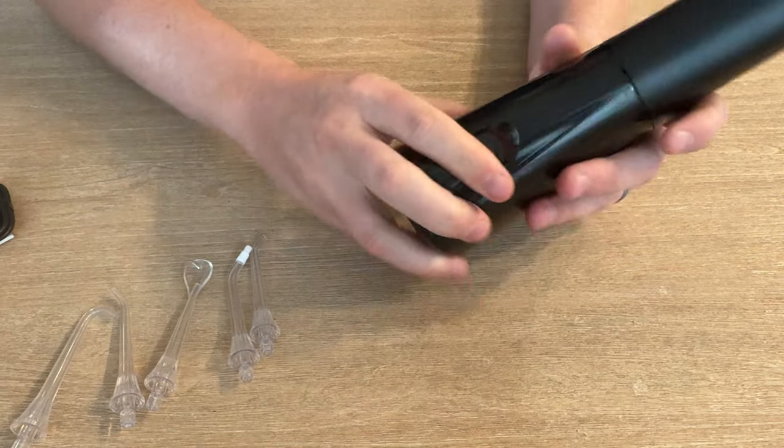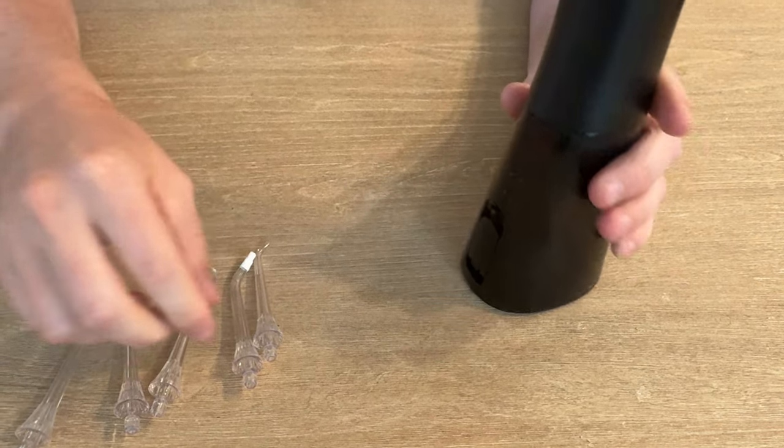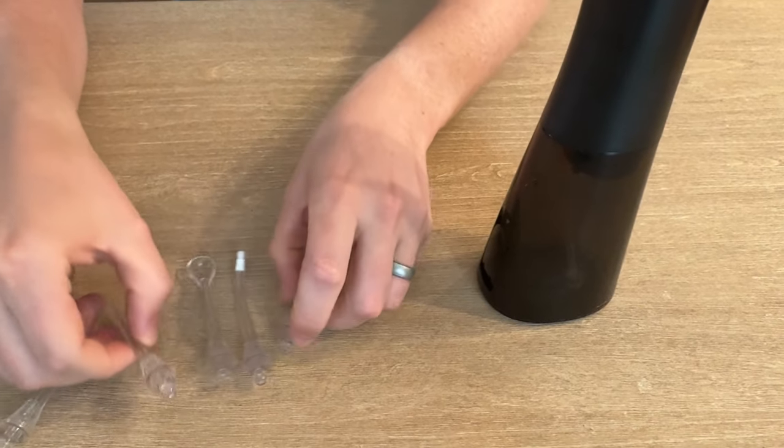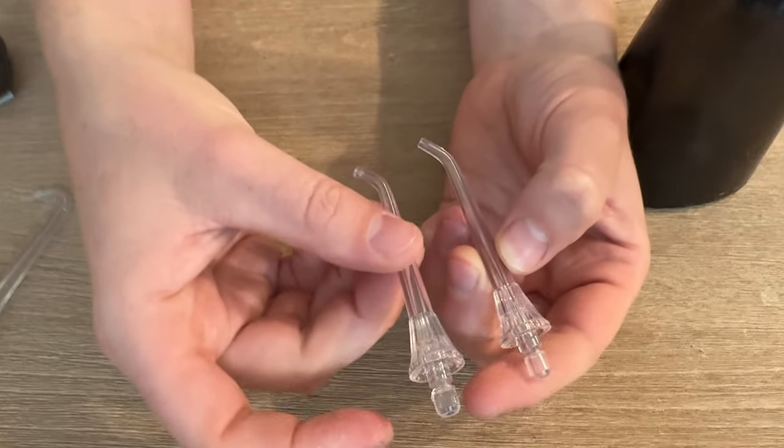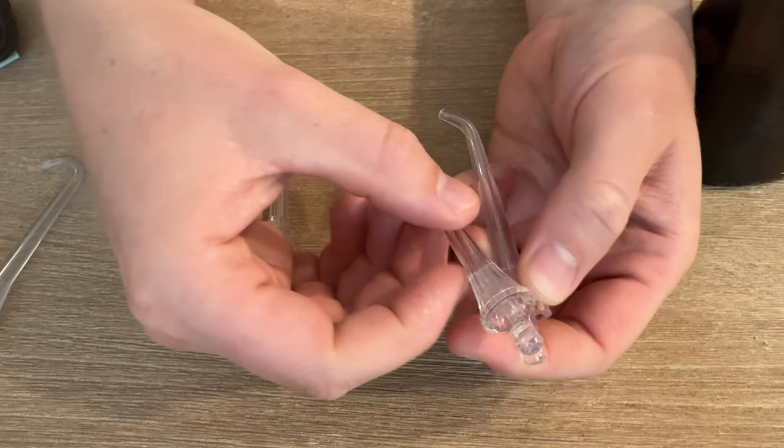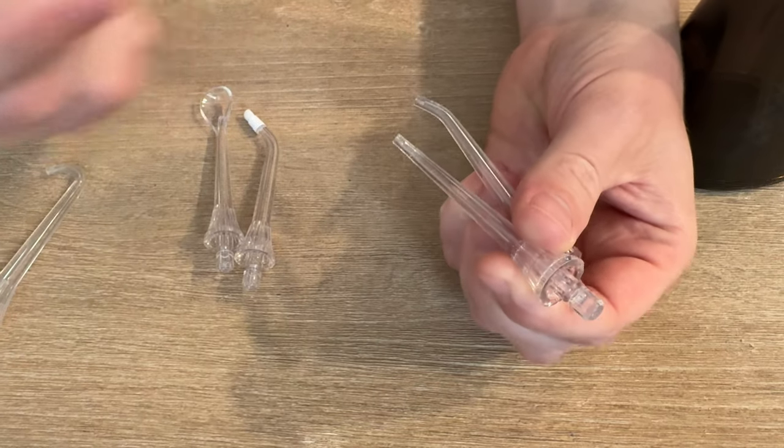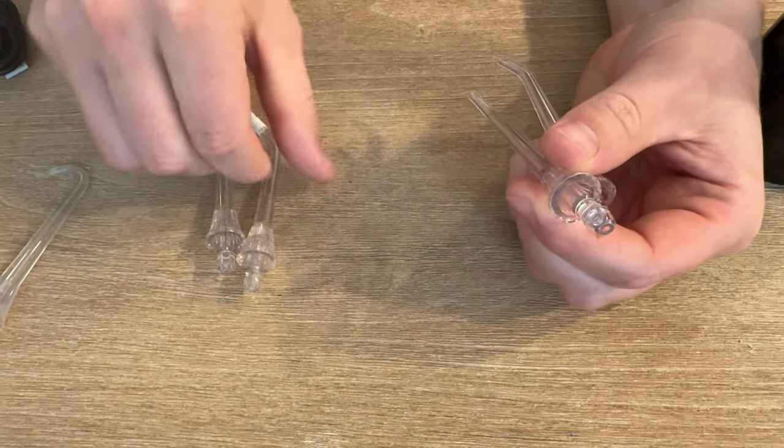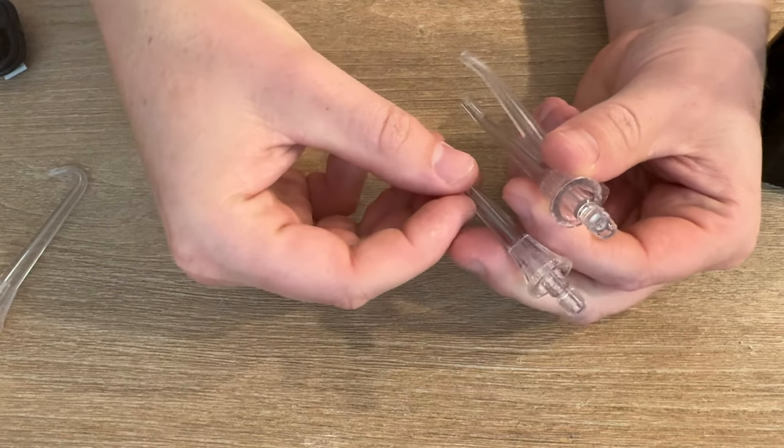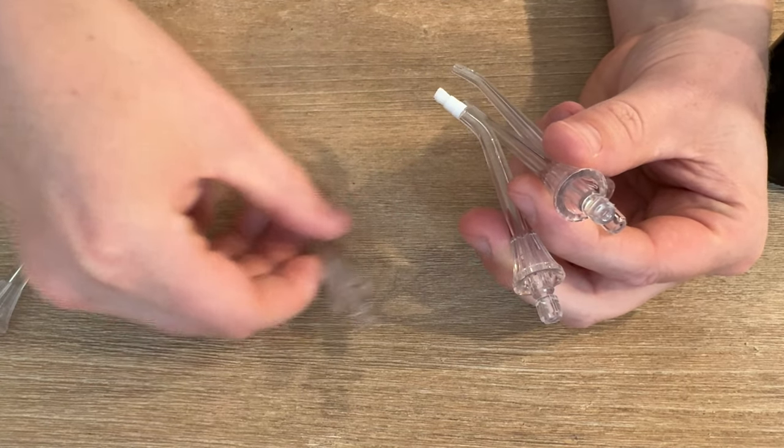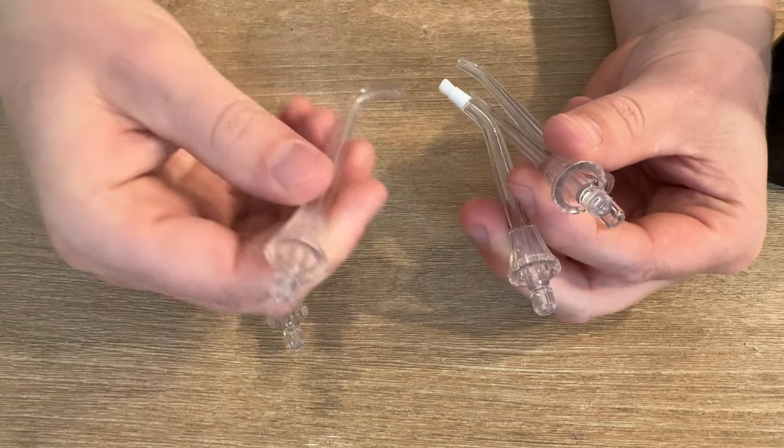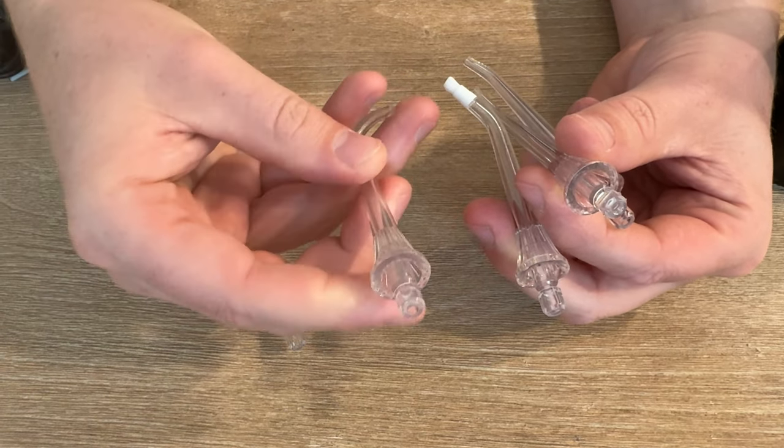It has a few different heads to choose from. It has these basically like water jet heads and then this brush head, the tongue head, and then this curve for getting behind your teeth.